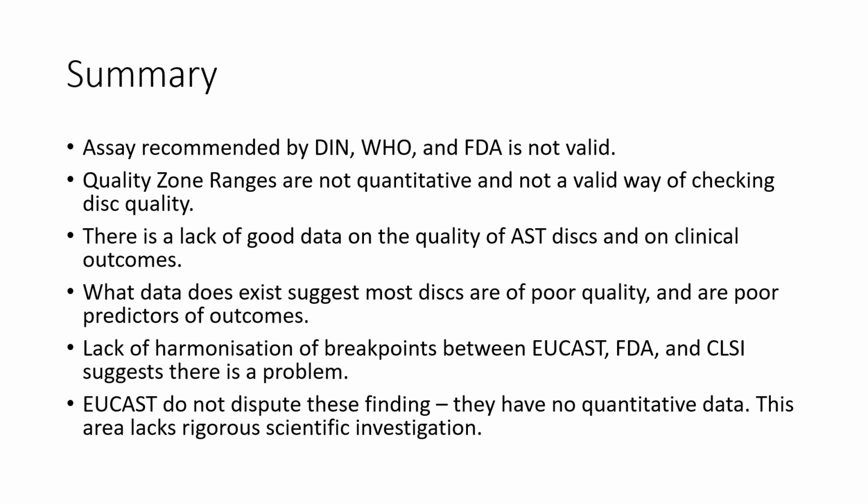So to summarize, the assay that is recommended by DIN, WHO and FDA is not valid. This is the assay that is carried out by manufacturers. The quality zone ranges that is published by a number of bodies is not quantitative and is not a valid way of checking the discs.